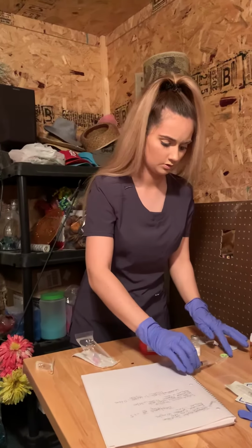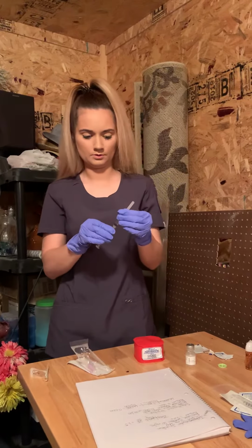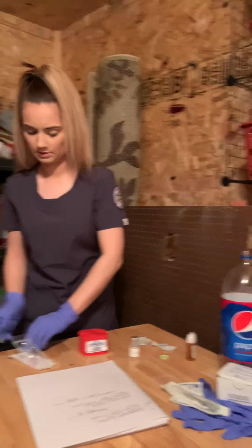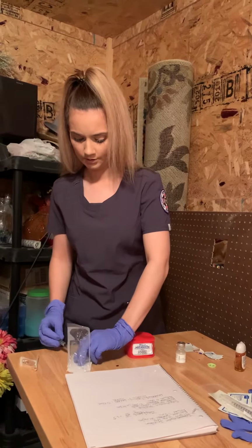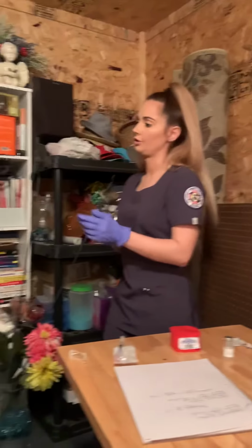You want to use the scoop technique to place the cap back on. Take the blunt tip off and put that in the sharps container. Then you can go ahead and put the needle on. For this injection, there are 3 different sites.